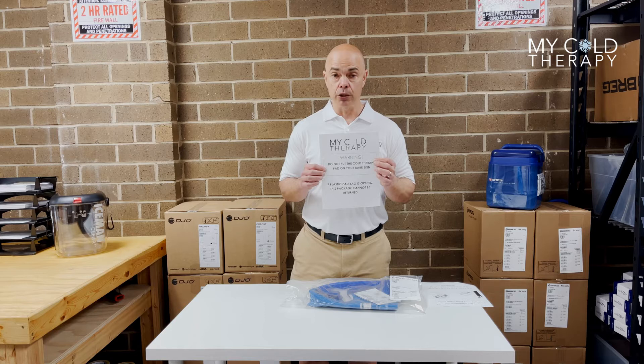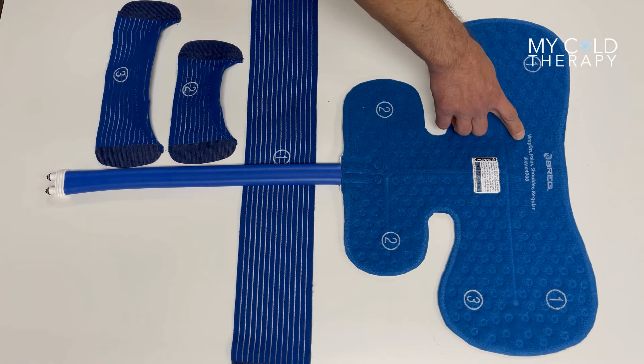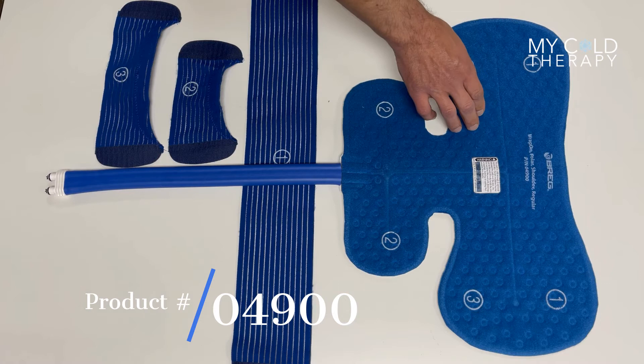Now we're going to talk about the dimensions and the straps and the hoses and the connectors on this particular pad. Every Brigg pad comes with a part number listed on the front. It says Wrap-On Polar Shoulder Regular Pad 04900. That way you know you have a Brigg Policar Cube Shoulder Pad.